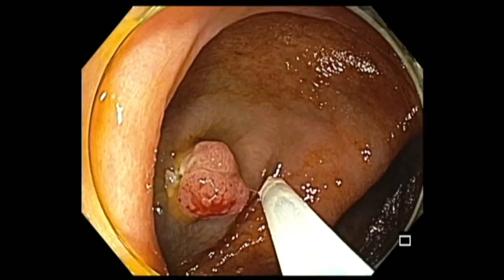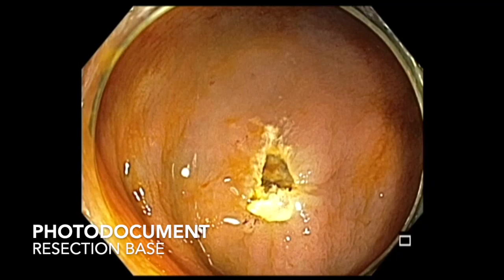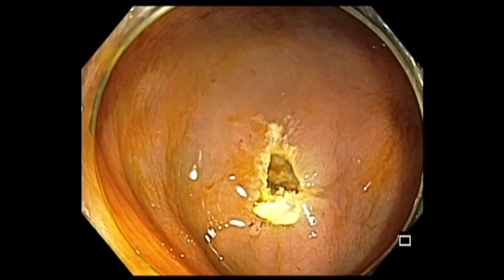And then once I do the resection, I try to document the base. These are all the steps I undertake every time I remove a polyp. And in the process, you could learn how to interpret each polyp. Thank you.